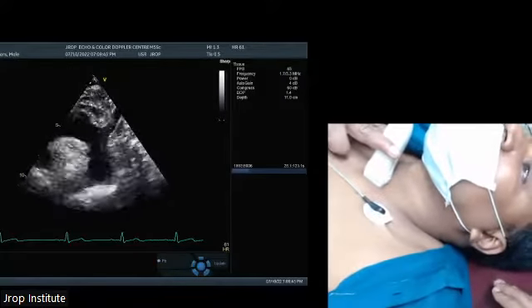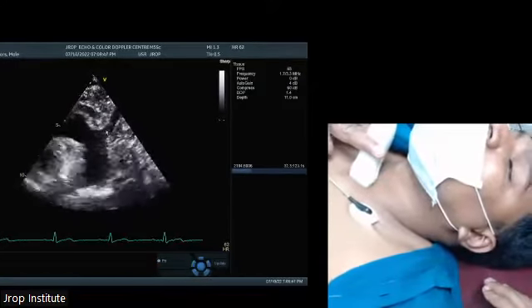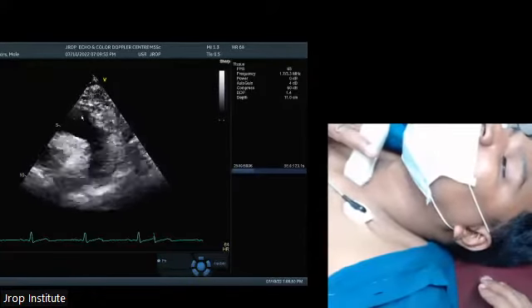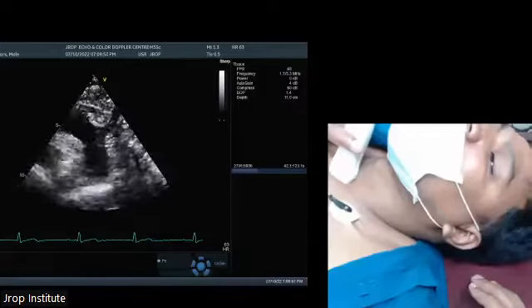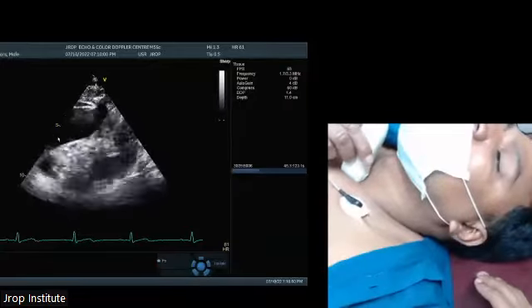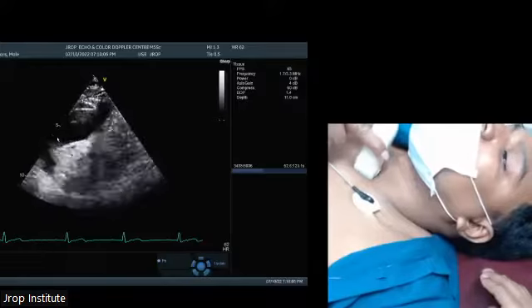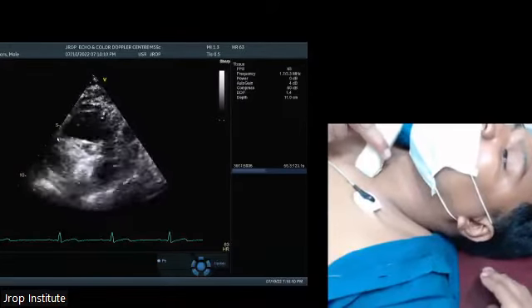I can see his left common carotid vessel over here, left subclavian. There's one more vessel over here, the innominate vessel. This is left common carotid, left subclavian, and this is descending aorta, and you can look, this is ascending aorta. Same tilting of the transducer, just the footprint is tilting. And you have to be very gentle and soft in putting the suprasternal window.